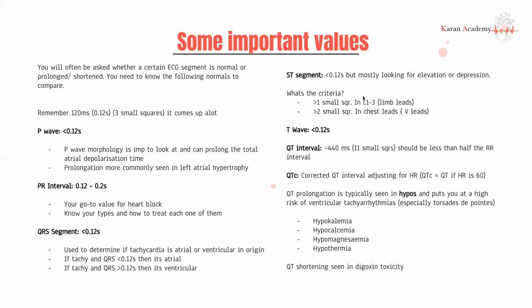And therefore, for something to be significant, it should be showing up at a higher level in the chest leads than it should in the limb leads.